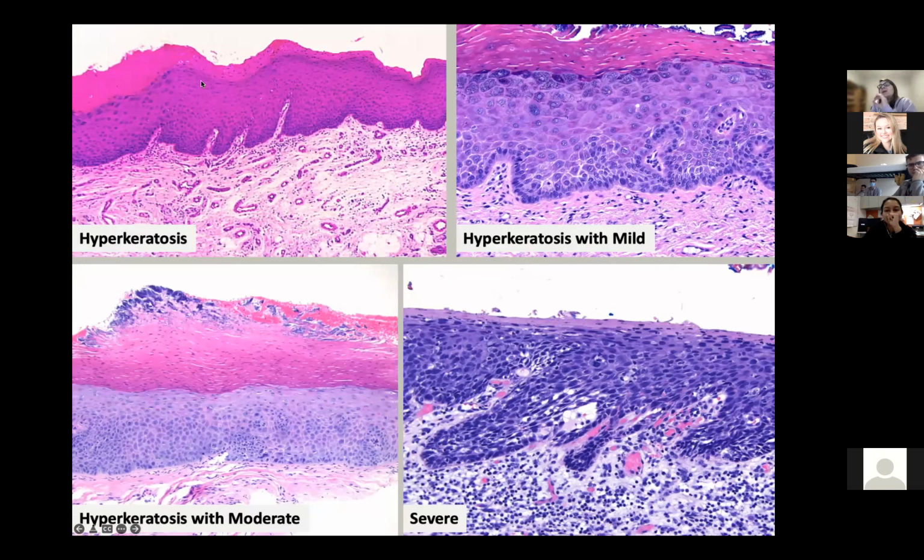But along with hyperkeratosis, often is associated dysplasia. So we always have to be mindful of the epithelium below that and look for things like disorganization of the basal layer, where the cells, I like to say they kind of look jumbled. Loss of polarity would be the appropriate term, but the nuclei are no longer uniformly oriented. They're kind of pointing in all directions. And you may see some that are large and more hyperchromatic compared to the others, which I'm trying to point out here.